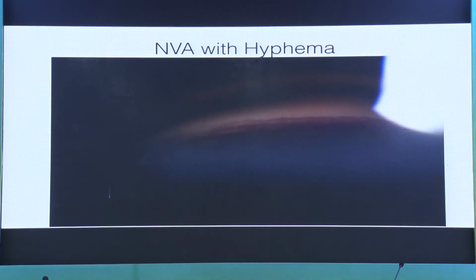Any of you want to prompt your possible diagnosis in this patient? Any clues? What you see here is a blood clot, and of course there is NVA in the angle. You can see the NVA, and there is a very micro hyphema. When you put the slit lamp and look, this was not seen. Only when we did the gonioscopy could we see this. Any idea what the possible diagnosis in this patient could be?